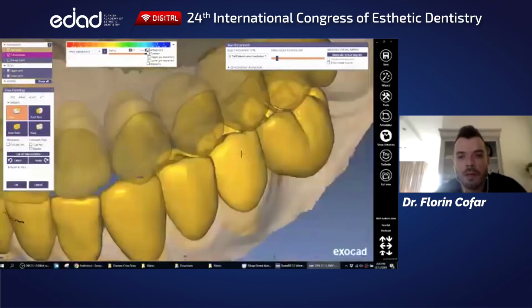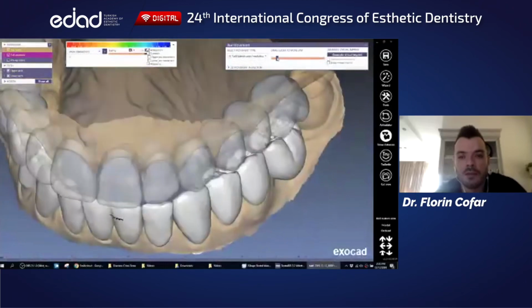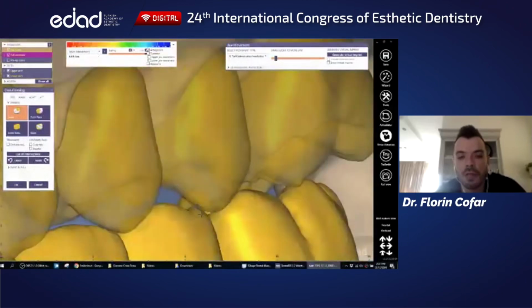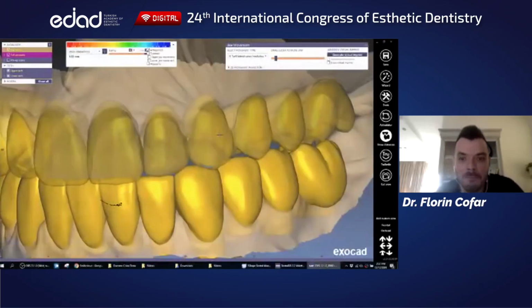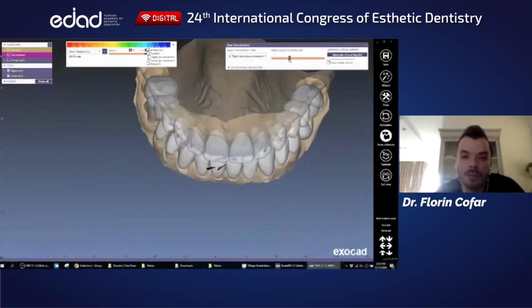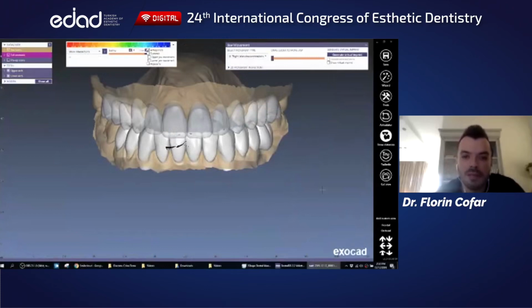And remember that this patient has been through splint therapy and is already stable. The only thing that we are improving now in the occlusion is creating a much more stable occlusion and fine-tuning it in dynamics. So at this point, we are not using an articulator, we're using the pure motion of the patient because I want to copy his occlusion, technically speaking.